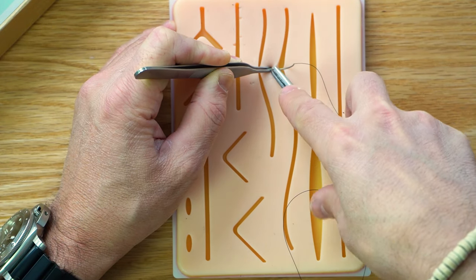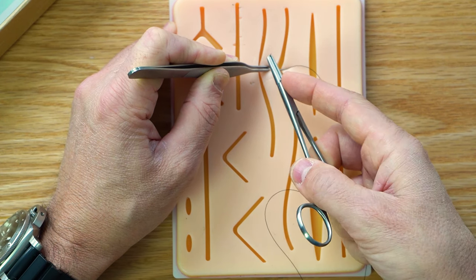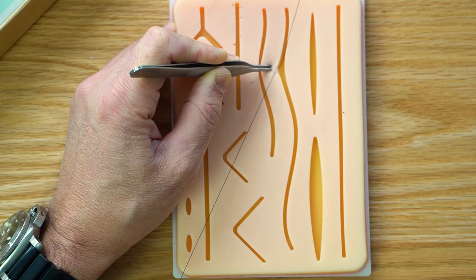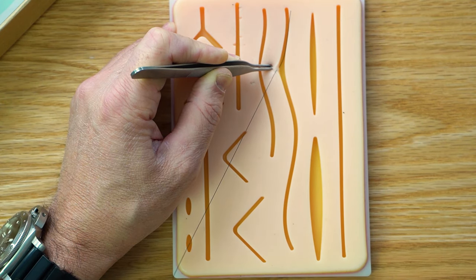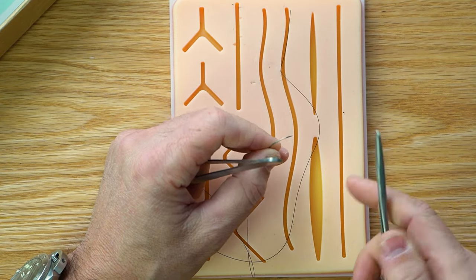I'm going to do that first. I'm going to go deep to superficial and superficial to deep, and then we're going to tie the knot deep, and the knot is going to be hidden, okay? So that's very important. If you're left handed, you're going to do the opposite. You're going to do the opposite side of yourself, but you're still going to go deep, superficial, superficial, deep.